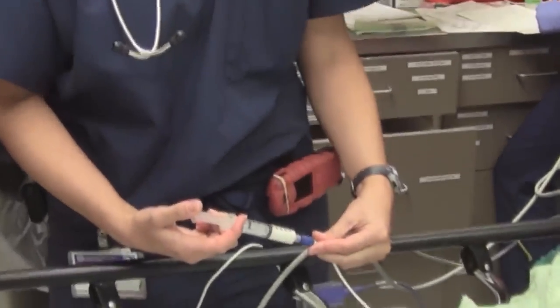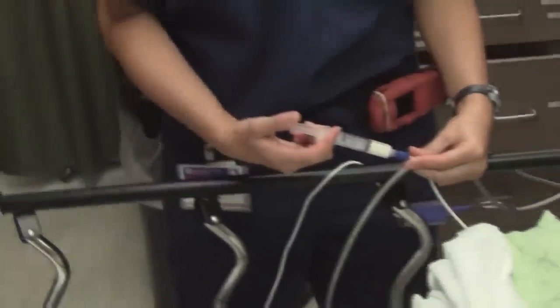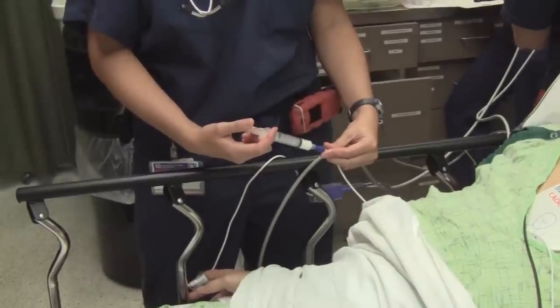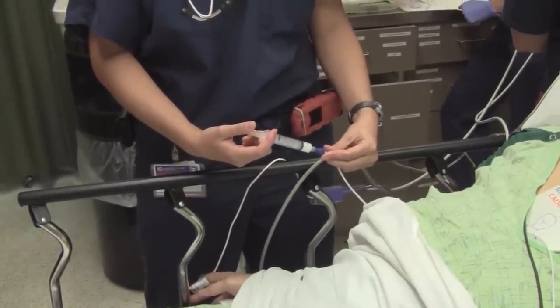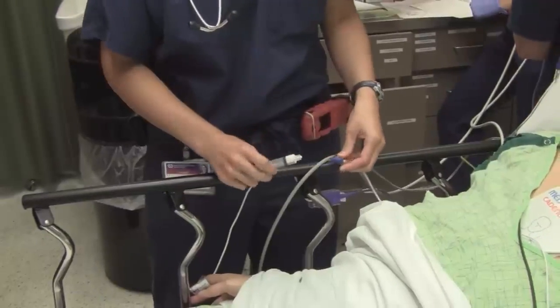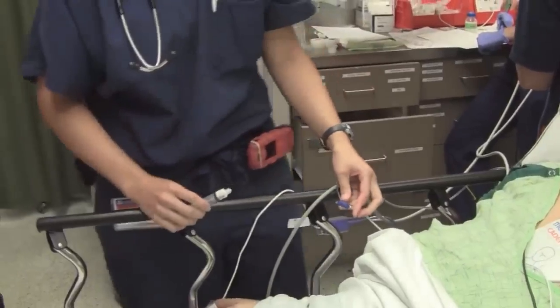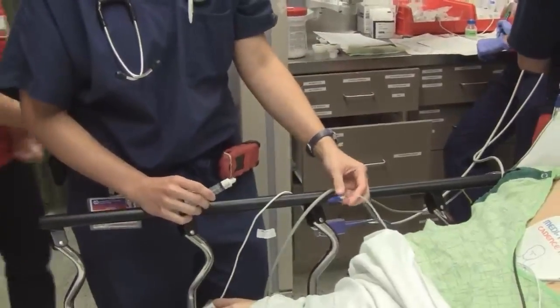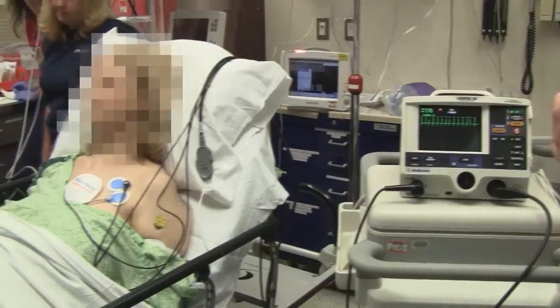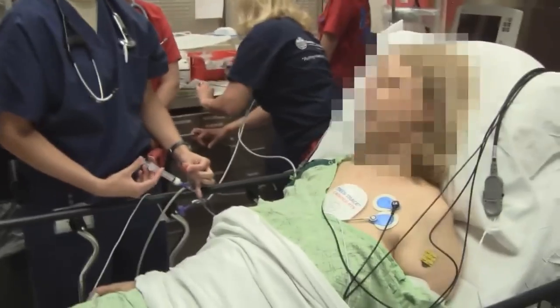Jessica, tell me what you're doing. I'm going to give her one milligram per kilo of propofol. When do I start the burning? Any moment. You may be one of the lucky ones that doesn't burn. It just feels full — it doesn't feel like it's burning. I'm going to give the other 20 and then the other one.